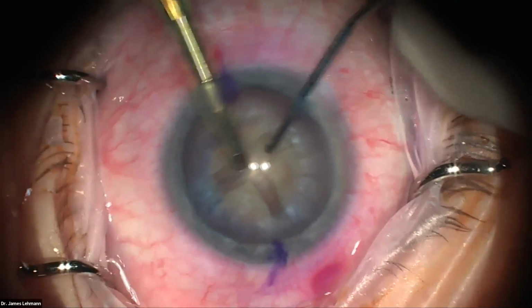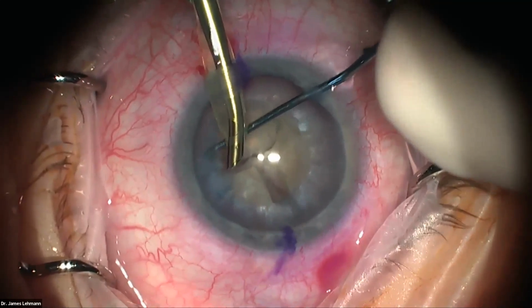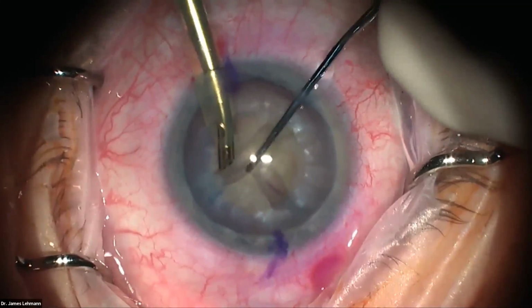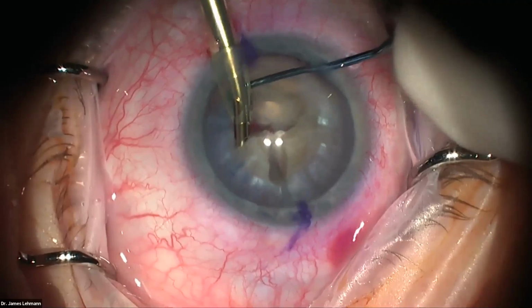And so that looks about the same. You can see down there in the trench. And then we just crack that gently. And then again, notice when I do this movement with my hands, I rotate my right hand to get the tip out of the way. If I didn't, guess where I'm going to be hitting it and going over. So that's a nice move to be able to do, that rotation.